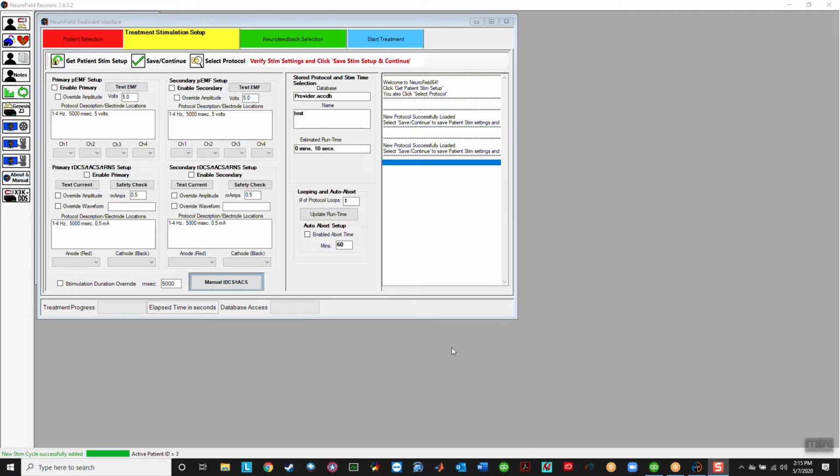I'm Nicholas Dogris, and we are going to talk about the Nogier database in NeuroField 64.